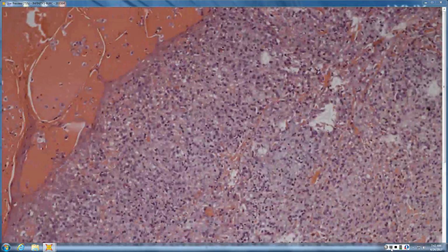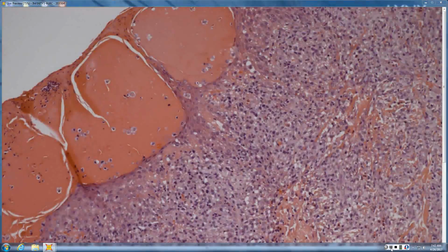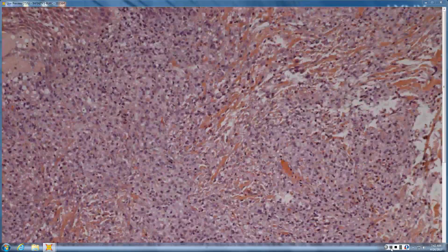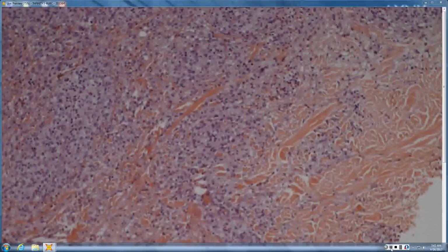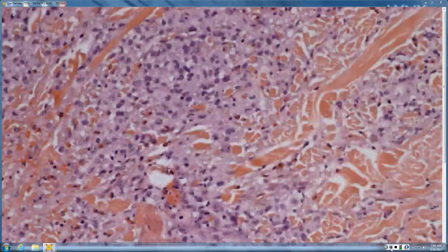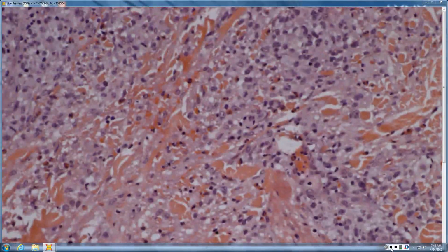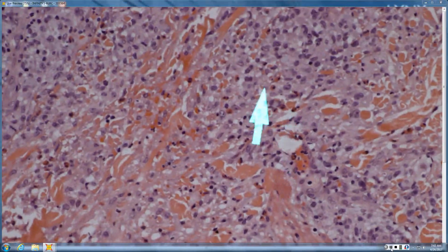Shane, you want to start us off? What do you see? So it looks like there's maybe an ulceration there, and there's a diffuse and maybe epidermotropic infiltrate. Okay, so there's an infiltrate that's diffuse and epidermotropic. So, in this chapter it may shock you, but a lot of things will have lymphocytes, right? The things that aren't lymphocytes, what else is here? EOs are there. Yeah, lots of EOs.